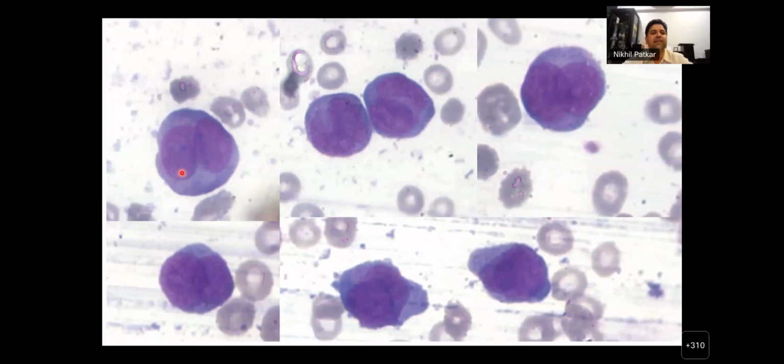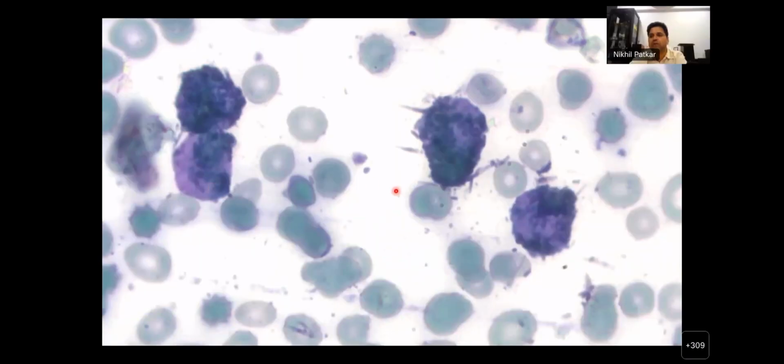These particular nuclei, what do they remind you of? What cells do they remind you of? Sir, abnormal promyelocytes, bilobed nuclei. Abnormal promyelocytes. And do you think that it is okay for these cells to have this degree of granularity in the cytoplasm, or is something off about that? Sir, there is less granularity as compared to a normal promyelocyte. What stain is this? This is myeloperoxidase. So what do you think here? Sir, the myeloperoxidase is positive, showing a positive reaction.